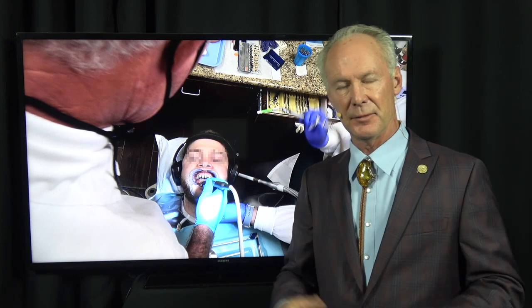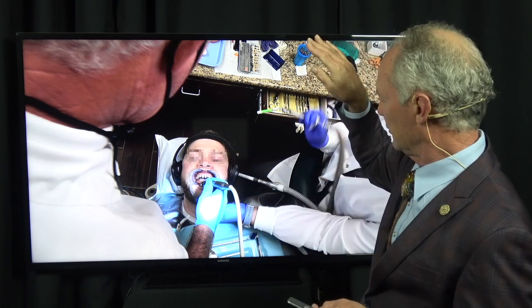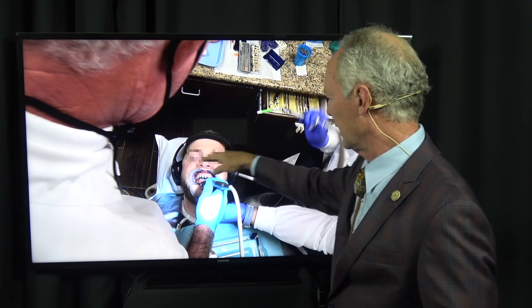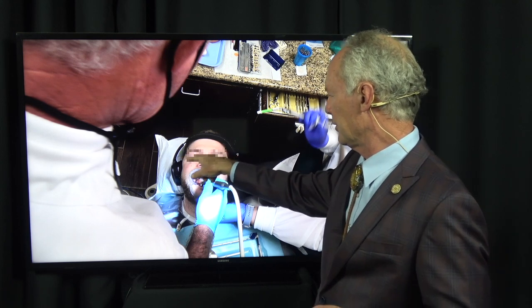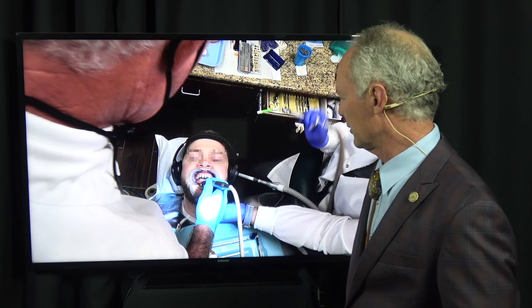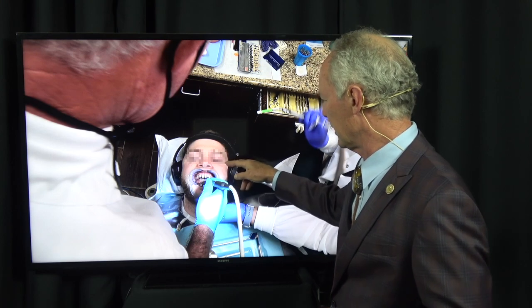Now this is showing how I prepare the incisal edges of the central incisors. I stand up and sometimes I'll tip the patient up, but I want to be sure I have a view back from the patient so I can see the pupillary line because I want the incisal edges of the centrals to be parallel to the pupillary line.